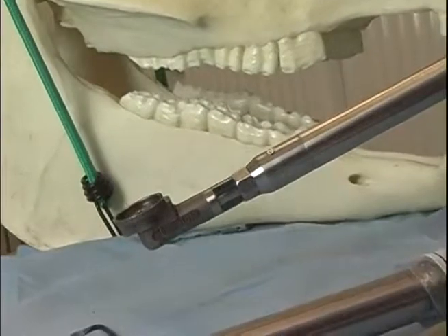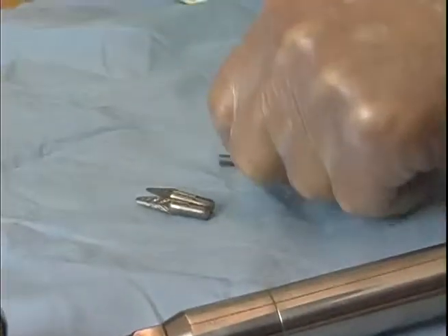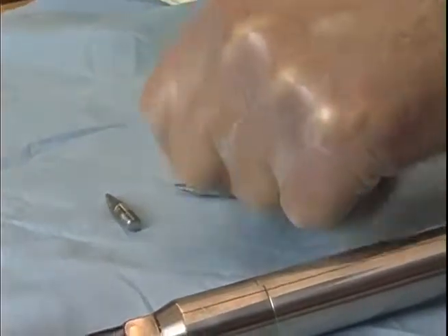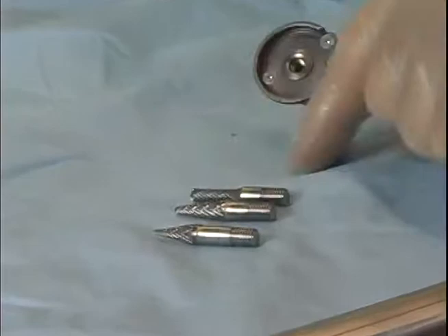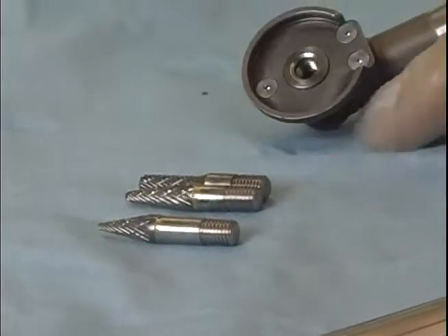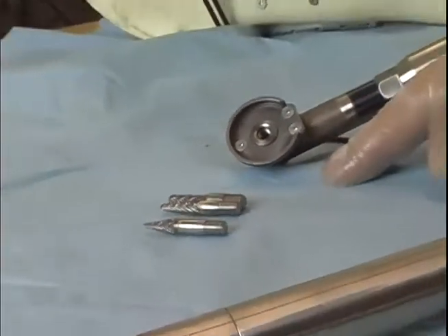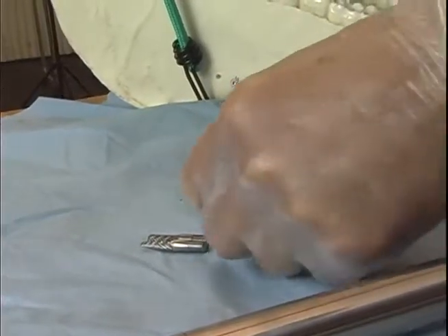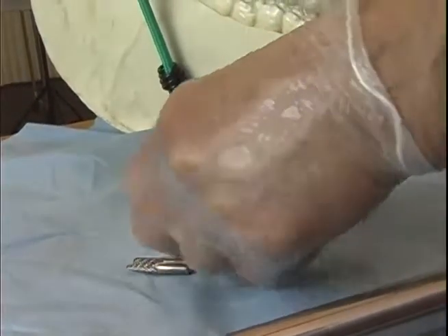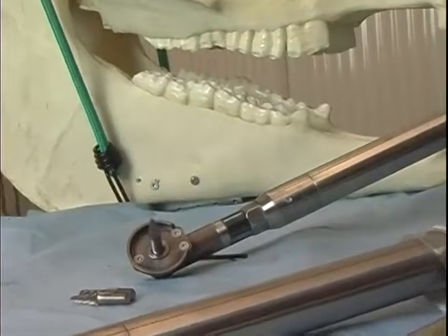These are Diastema Burrs. They come as a set of 3, and they are used to burr a path between teeth that have food trapped in them, if they have a true diastema or a valve diastema with food packed between the teeth. So each burr will thread into the float, and it will spin.